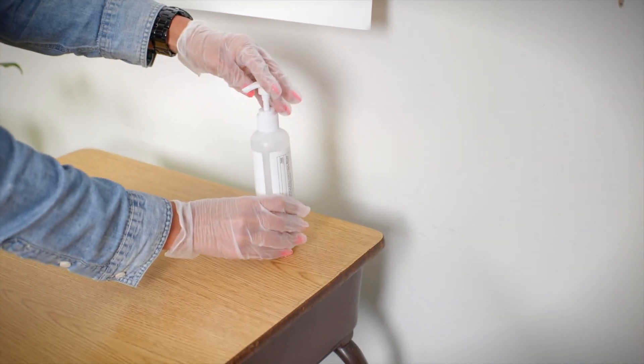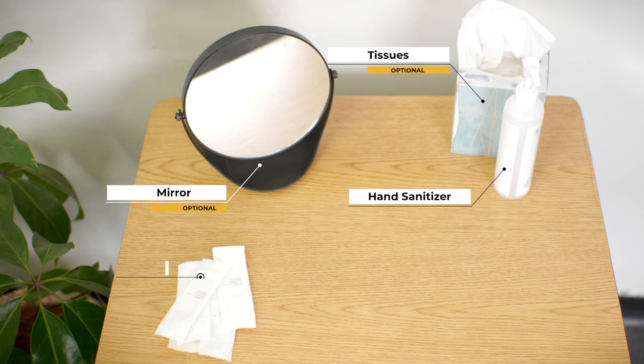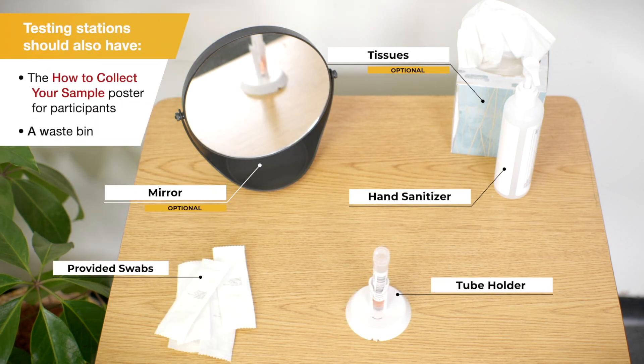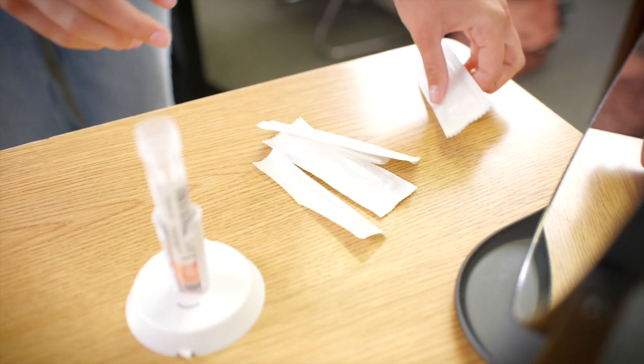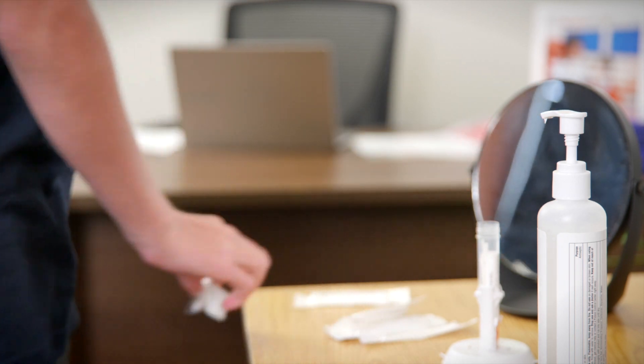Before setting up the station, be sure to wipe down the table with a cleaning solution. Each testing station should have the following items you see on your screen. The testing station should be on a flat surface and set up so that participants can easily reach everything, including placing their swab in the tube without removing it from the holder.